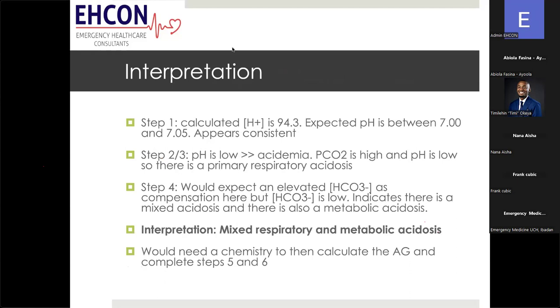We may seem to be going quite fast, but I assure you that if you take these steps and you practice them with all of the gases that you're seeing, you're really going to see an improvement in your ability to interpret them. So just do them each time until you get very facile with thinking through how to interpret ABGs.